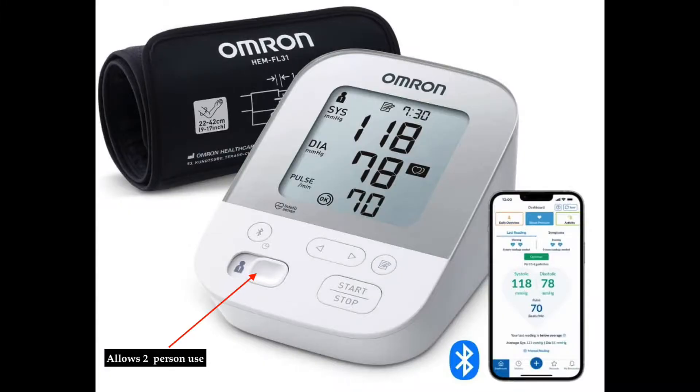The X4 has been tested against other blood pressure monitors, and you can see the readings here. I think personally that the readings are comparable to other blood pressure monitors. If you think otherwise, drop me a comment. The X4 also allows two people to share this blood pressure monitor — there is a button which you can push that shows whether it's person one or person two using it.